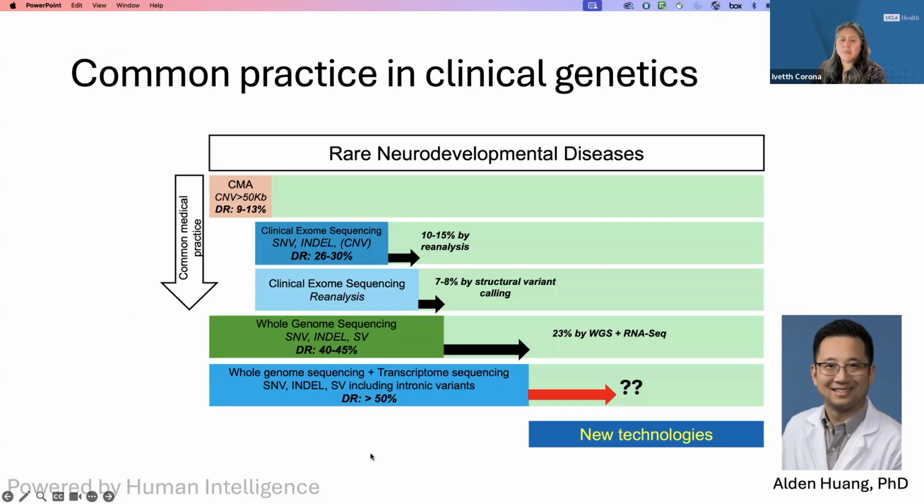I'm hoping that long read at some point shows, I mean, we already know that it's going to be useful. But I think it's basically going to be another resort after maybe whole genome sequencing has been done. Maybe I'm wrong, I have never made predictions on biotechnology, but it could replace the other ones. But when did we have whole genome, and we still have whole exome happening, right? So I think it's a long road for that to happen. Yes, that's a great point.